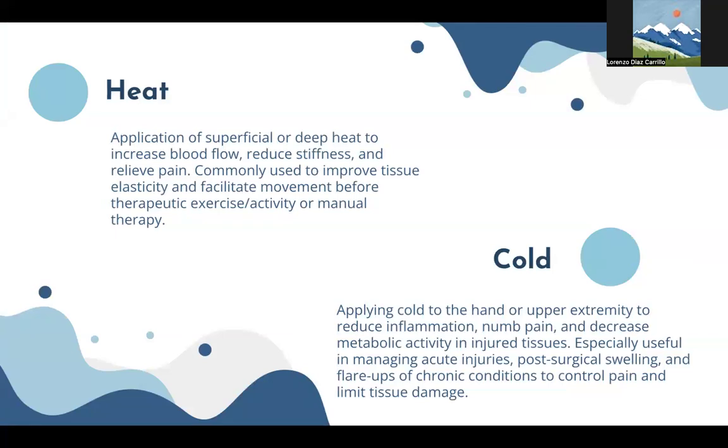You'll find that with your patients within a hand therapy clinic, this might be their favorite part of the therapy. It's definitely the most physically relaxing when you're applying heat to that affected area. Again, it improves tissue extensibility, which allows them to perform more movement afterwards and perhaps even less painful movement as well. So it's very useful and beneficial to use prior to activity.